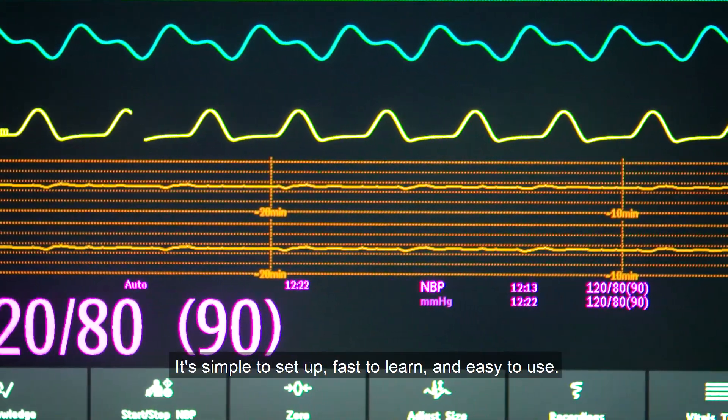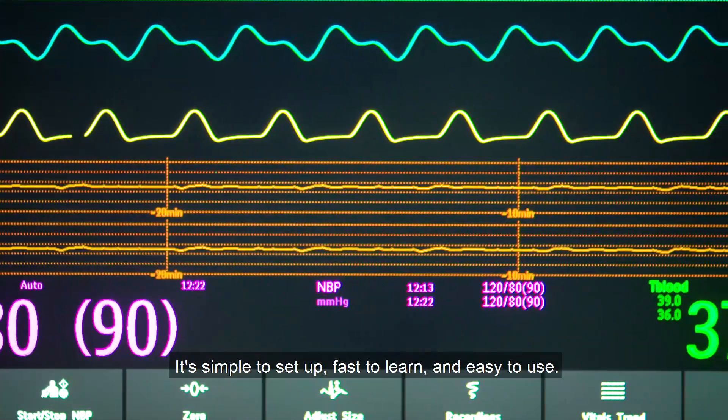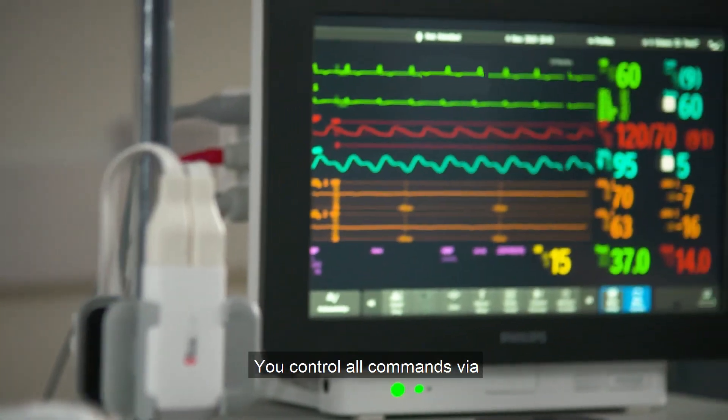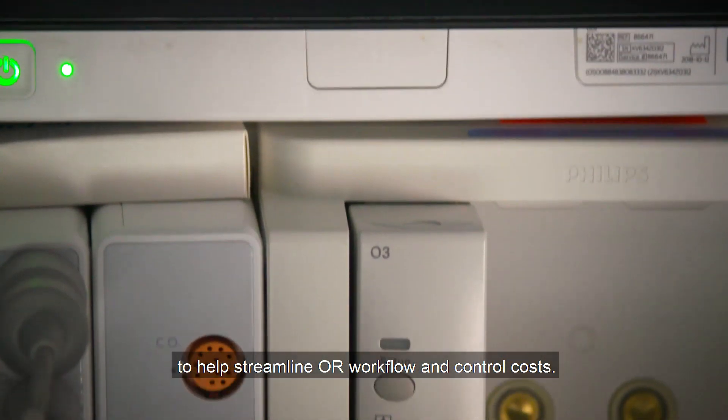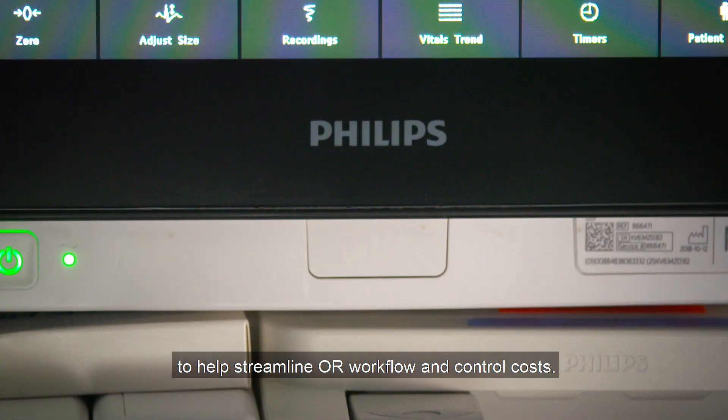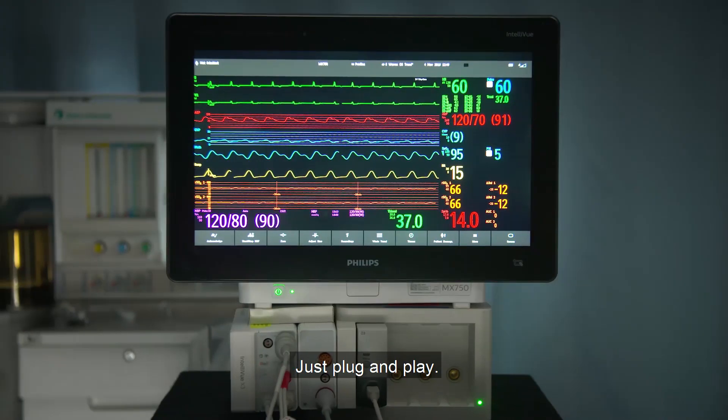It's simple to set up, fast to learn, and easy to use. You control all commands via the familiar Intelliview interface to help streamline OR workflow and control costs. Just plug and play.